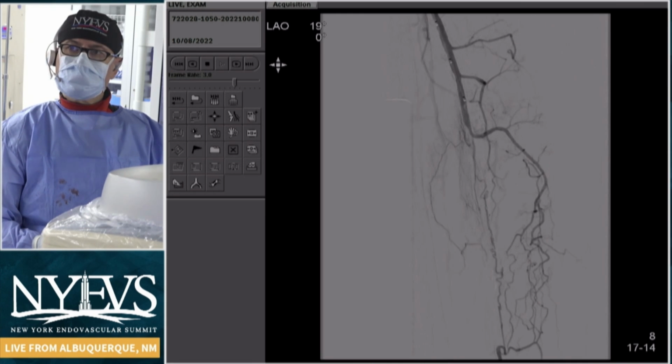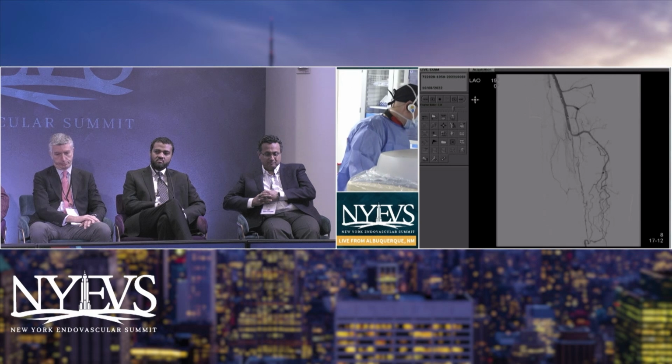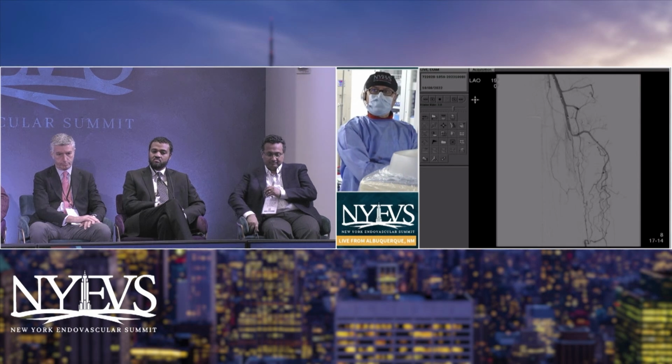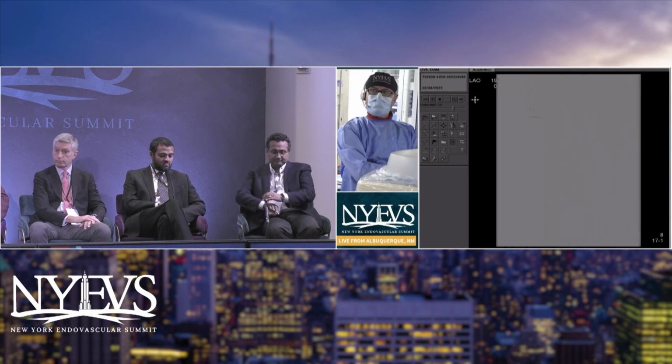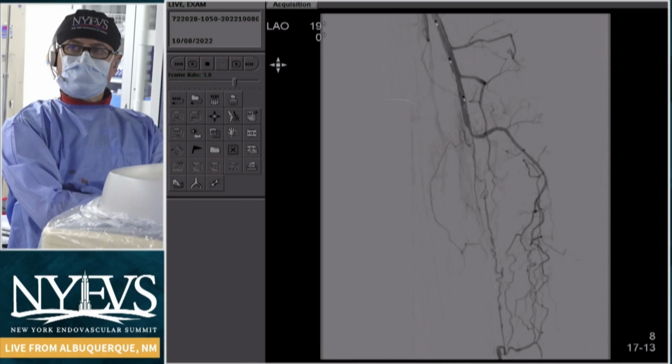So we've got a great panel today. We've got George Chrysanthos, Peter Ferrugia, Dr. Finelli, Brian Fisher, and Sahil Parikh. So any comments from the panel? It looks like we've crossed. What would be your next step here? I think most would agree IVUS, and then what about after that?